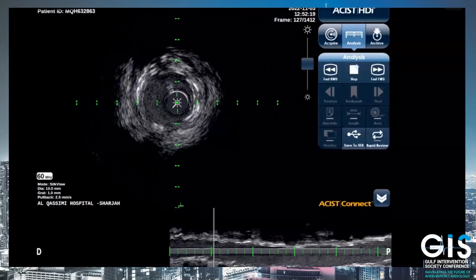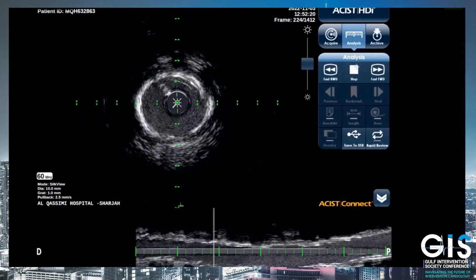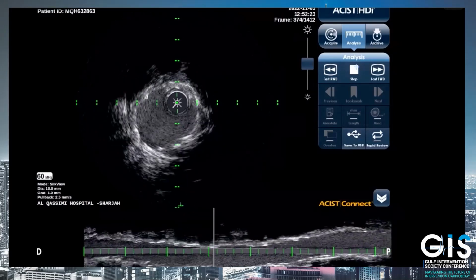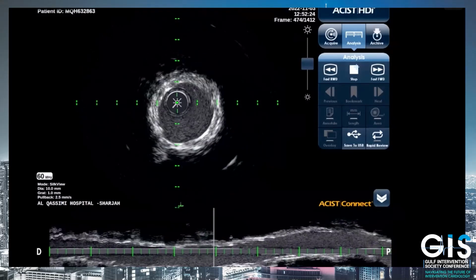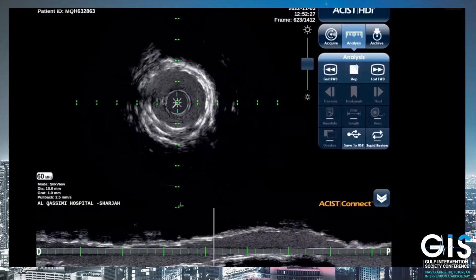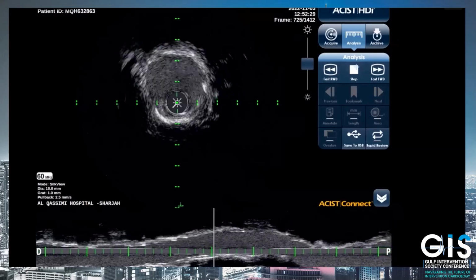Again, the same argument I have. At the moment, this patient was served nicely with establishing flow through 2 tight lesions, and that very distal LAD, to have any kind of flow is there. So I don't think it's necessary at this stage. We can call him back later on and reassess him. But I don't think prognostically, frankly said, that this will affect his prognosis much.